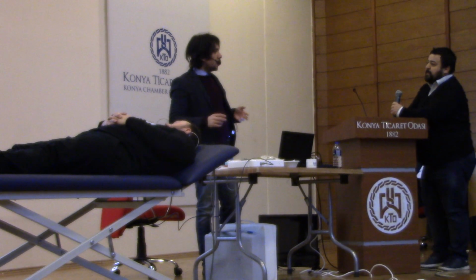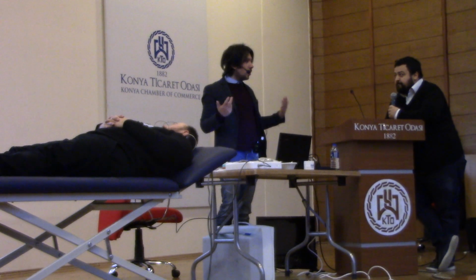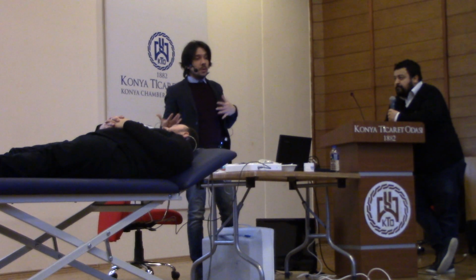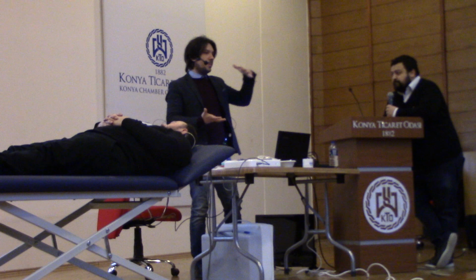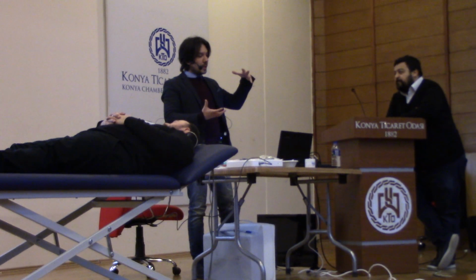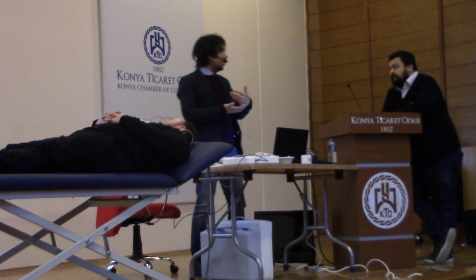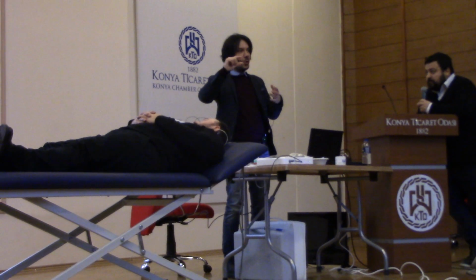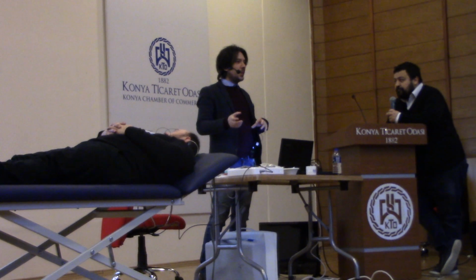The useful features of a chirp stimulus are mainly two. First of all, you can go through the threshold with a very stable and higher peak. And the second is that it will immediately disappear after the threshold level. So in a normal click, generally when you reach the threshold, you have a small peak.